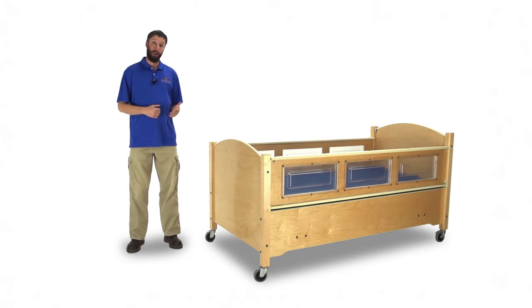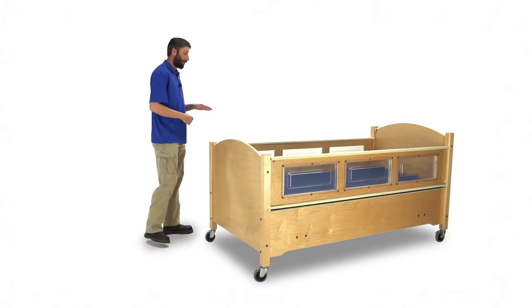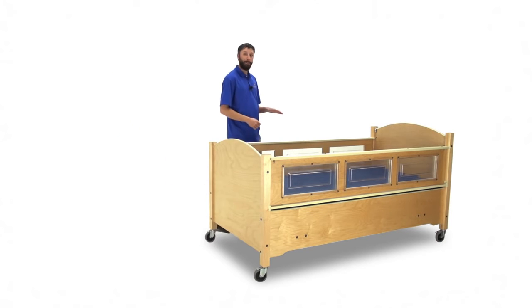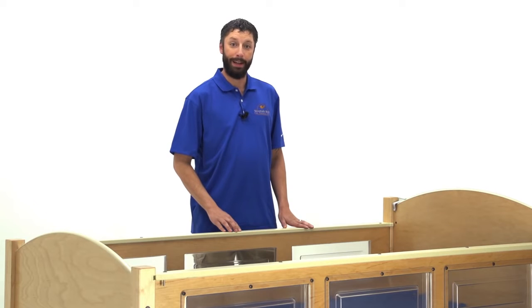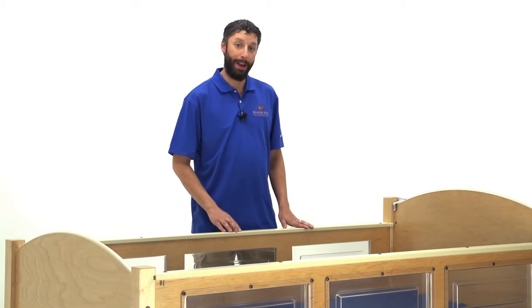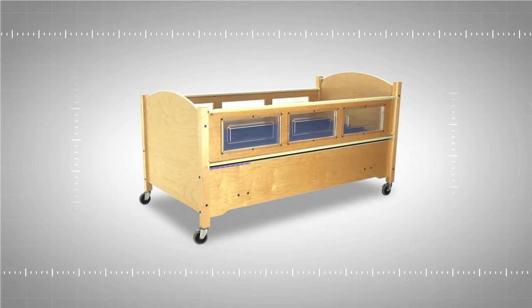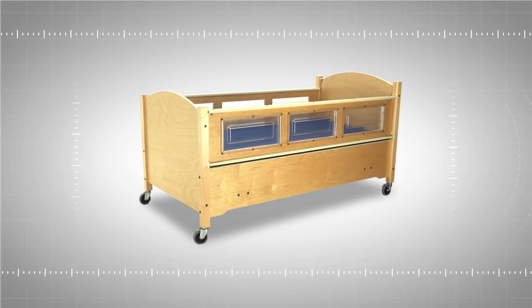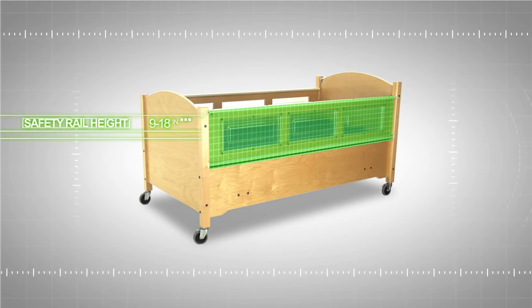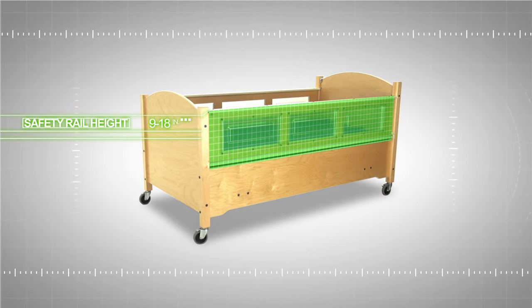First off is our low bed, the SleepSafe model. This bed is designed with low safety rails to give the caregiver more direct access to the individual in the bed. This design is ideal for an individual who isn't very active and who understands the dangers of falling out of a bed. It offers the lowest transfer height of all the models at 22 inches and a safety rail height range of 9 inches to 18 inches depending on your foundation choice.